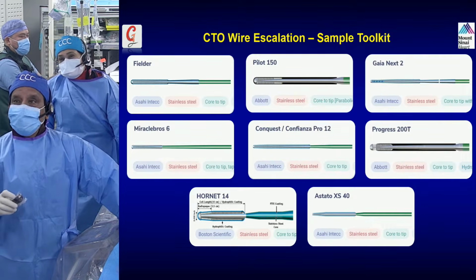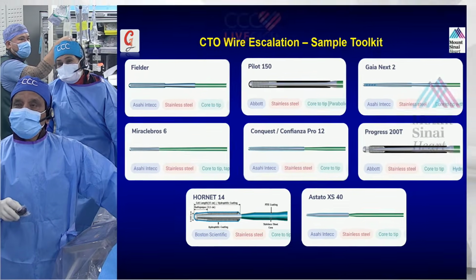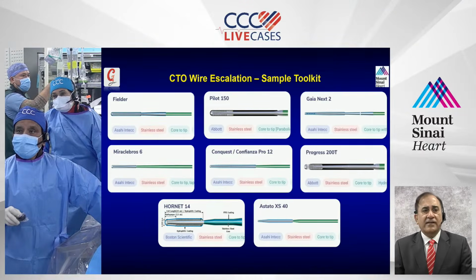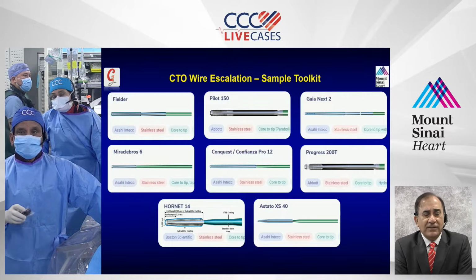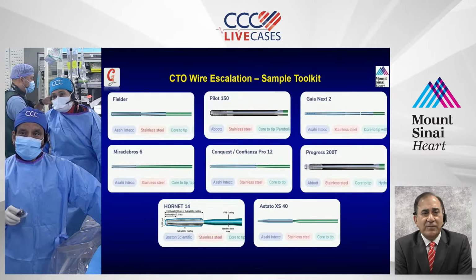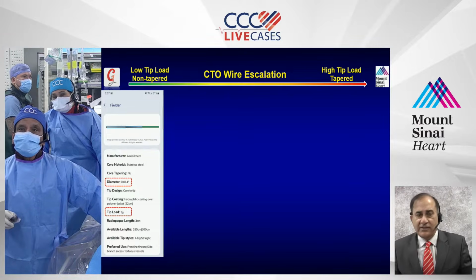Look, call it remarkable. And what I find so challenging here is that every few months you have to update these. New wires will keep coming, so there's constant work for the people creating this. But beautiful, it's such a lovely illustration of the method.